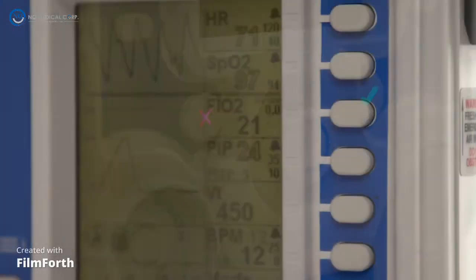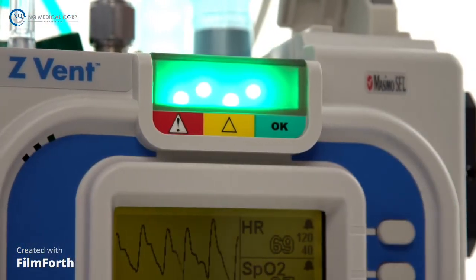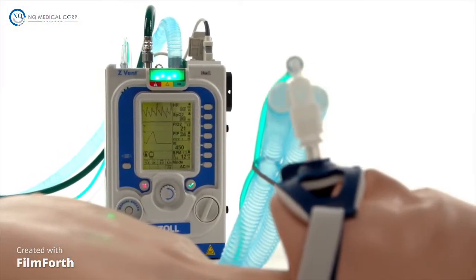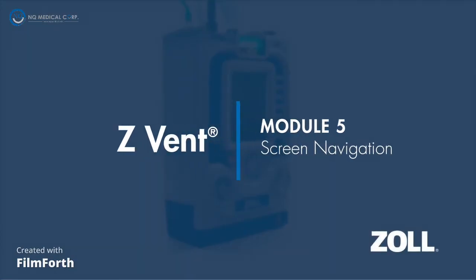Hello and welcome to the ZOLL Z-Vent in-service demonstration. This multiple-part series will provide detailed information about the Z-Vent portable critical care ventilator and its functionality. In this module, we will review how to navigate and configure parameters.